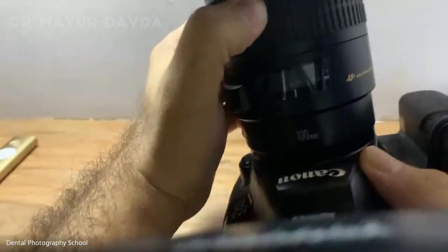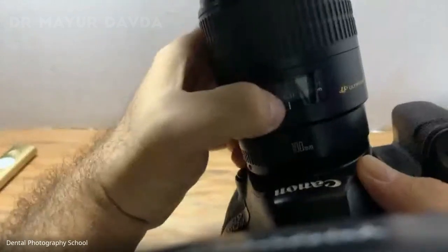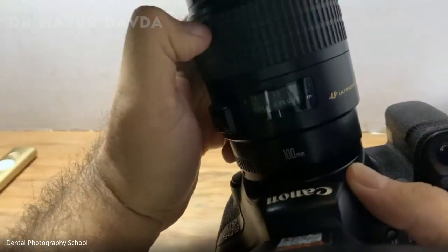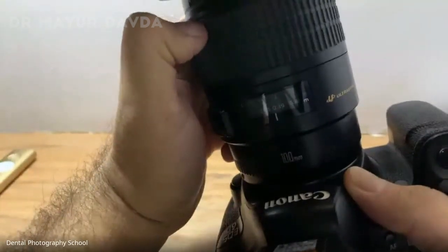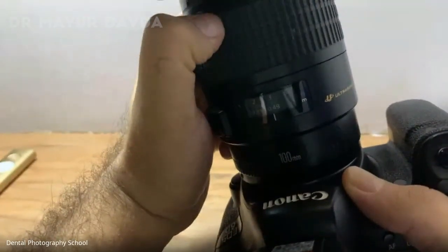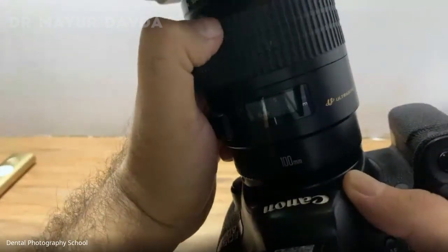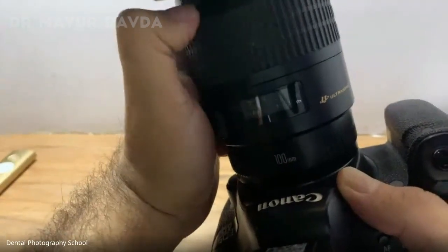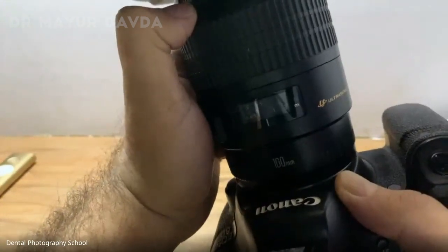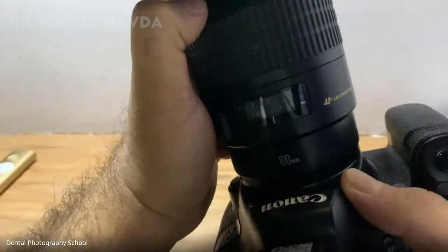But I think you can see. So it's at 1:1 right now. Can you see that? If I rotate it, it becomes 1:1.5, 1:2. Can you see that? 1:3, and see the yellow color numbers only. 1:5. The topmost yellow color numbers. Okay, don't bother about the green and the white.